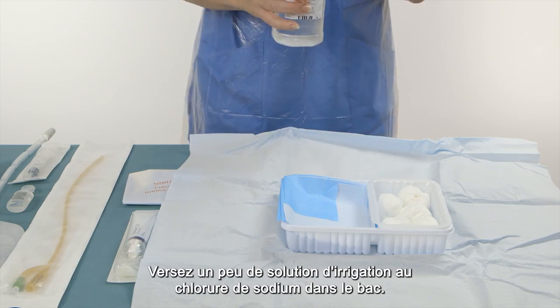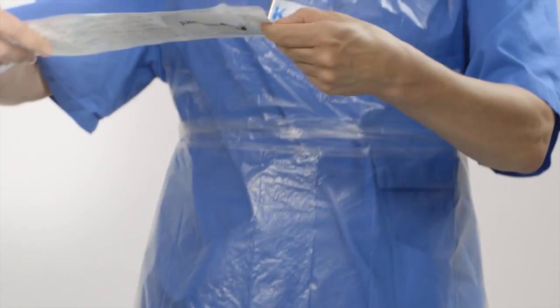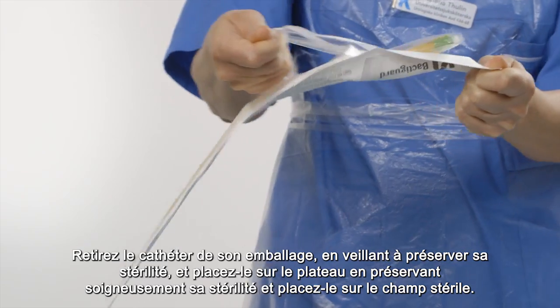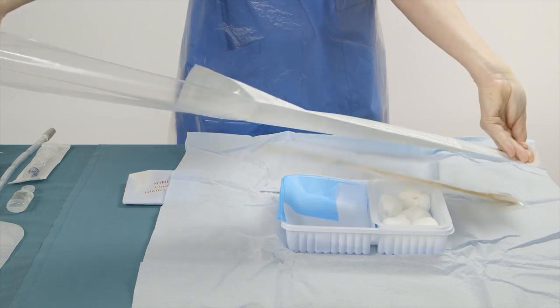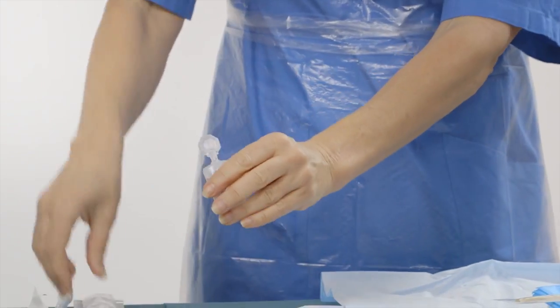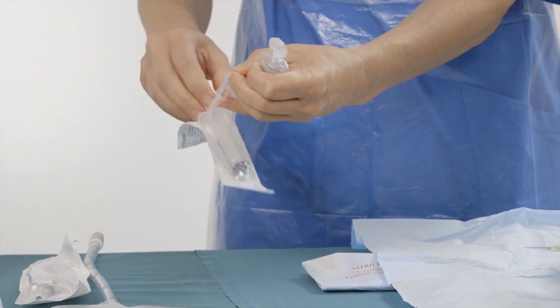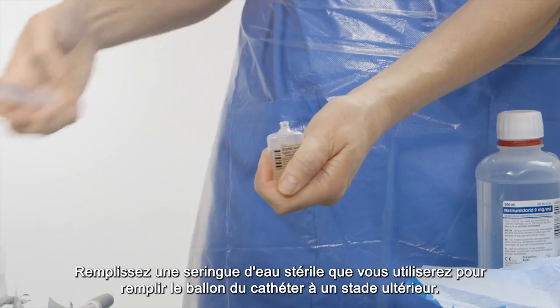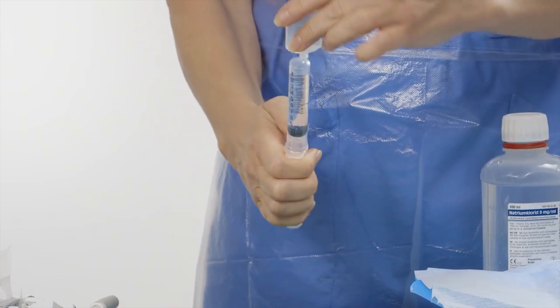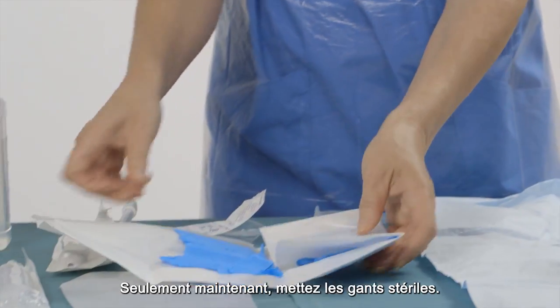Pour some sodium chloride irrigation solution into the tray. Remove the catheter from its packaging while carefully keeping its sterility and place it on the sterile field. Fill a syringe with sterile water that you will use to fill the catheter balloon with at a later stage.